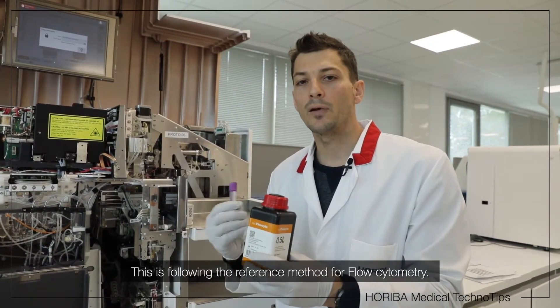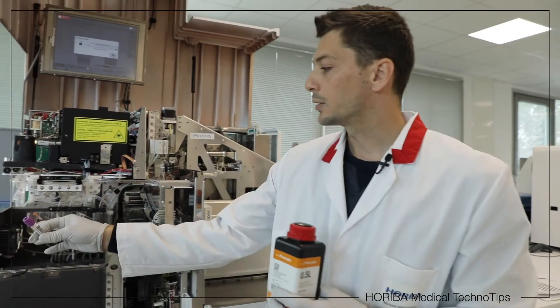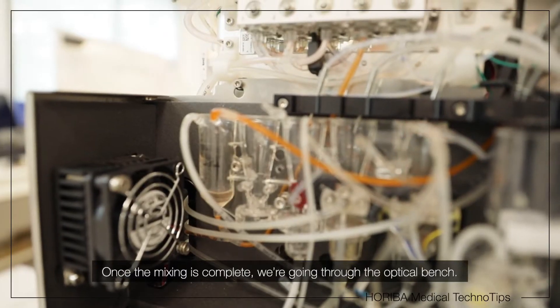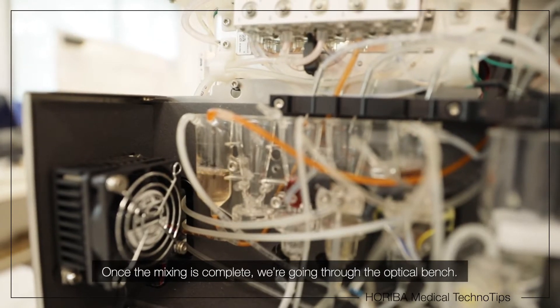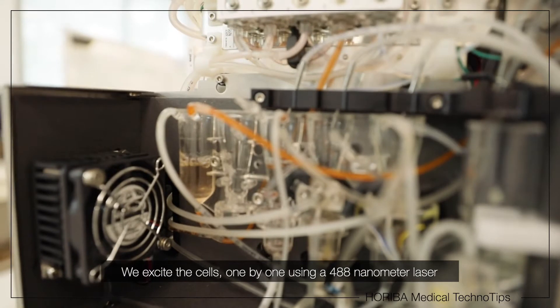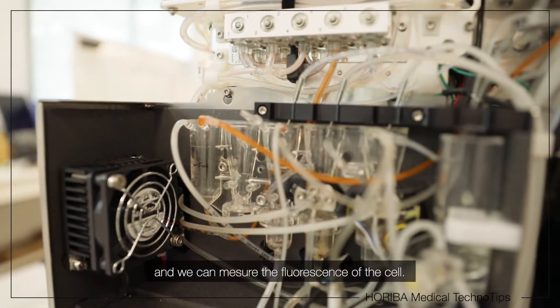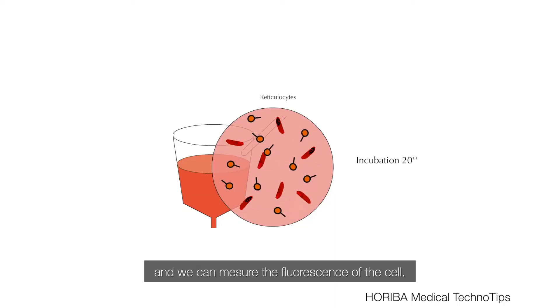This is following the reference method for flow cytometry. Once the mix is done, we go through the optical bench and we excite the cells one by one with a 488 nanometer laser, and we can measure the fluorescence of each cell.